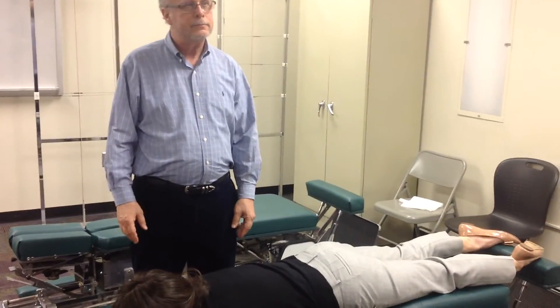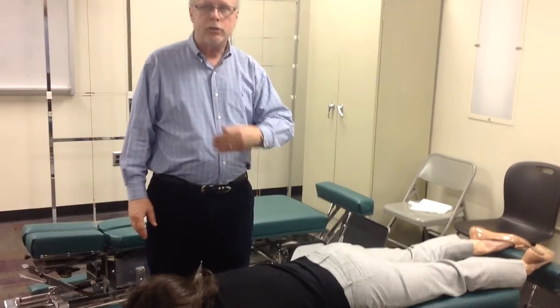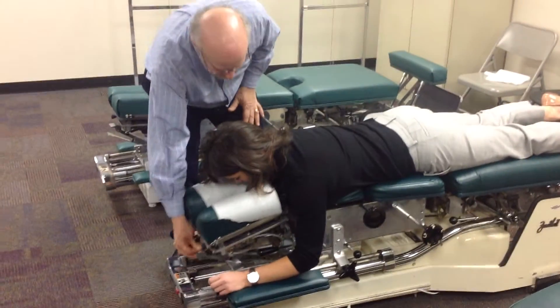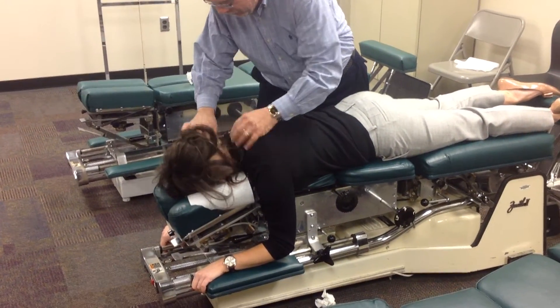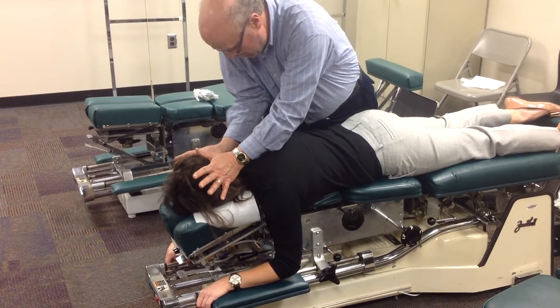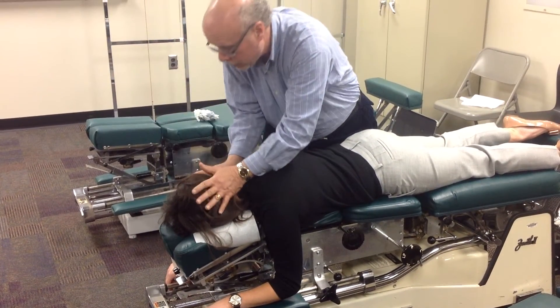The bilateral cervical syndrome setup: she starts balanced, turns left and gets a left short leg, turns right and gets a right short leg. Tilt the headpiece down all the way, she tucks her chin in. Double thenar contact to the back of the head, get the elbows together and down, thrust inferior to superior and come up to the ceiling.